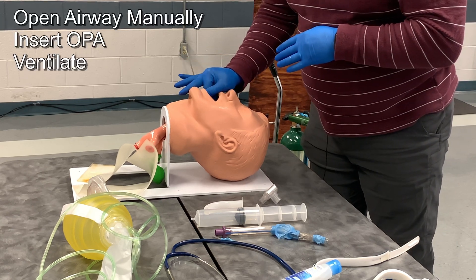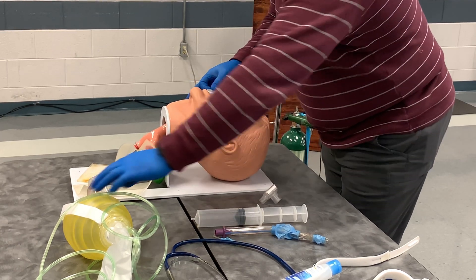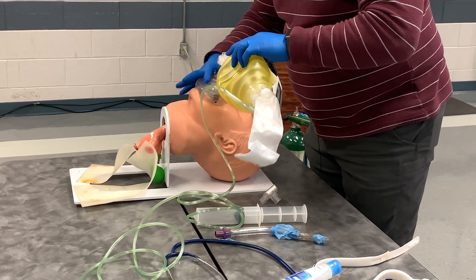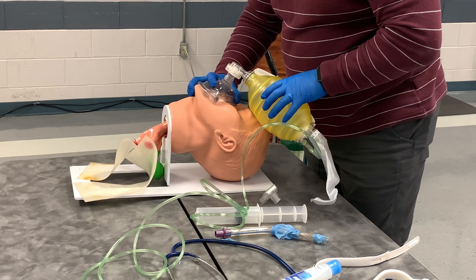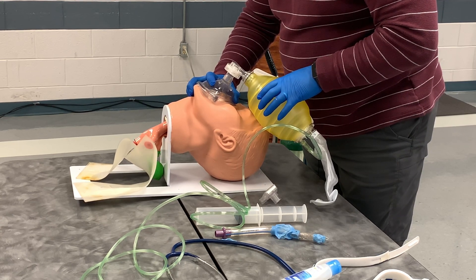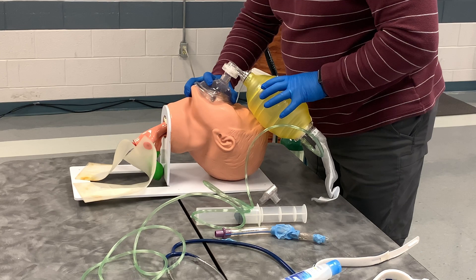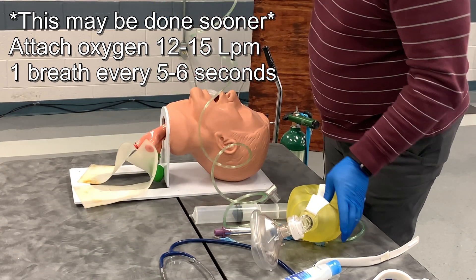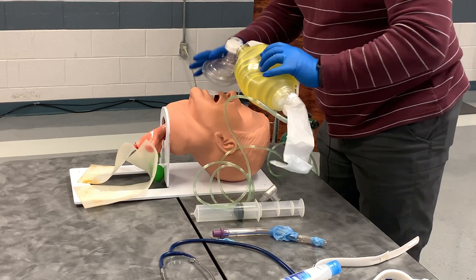I will open up the airway using cross-finger technique. I do not see anything in the airway, so I will insert the appropriate size oropharyngeal airway and begin ventilating my patient — one breath every five to six seconds. I have attached my pulse ox and it is reading 85%, so I am going to attach my bag valve mask to oxygen at 15 liters per minute and continue ventilating my patient.